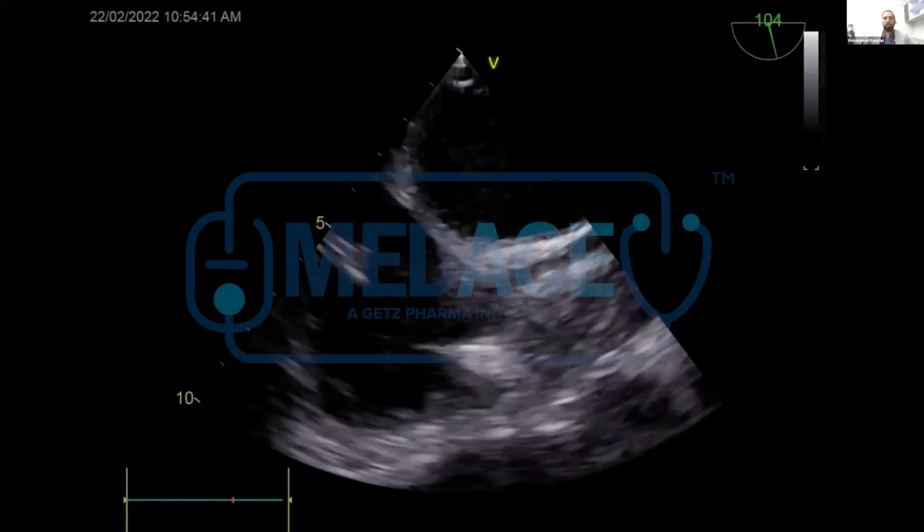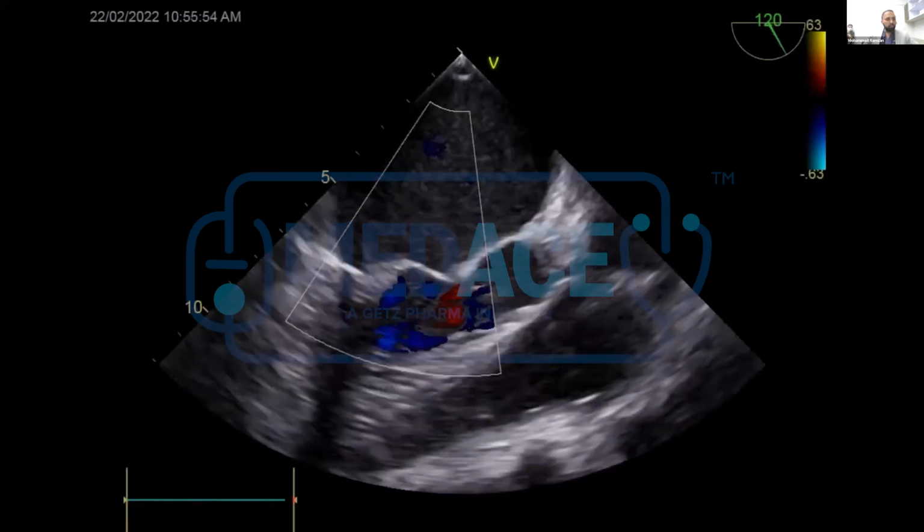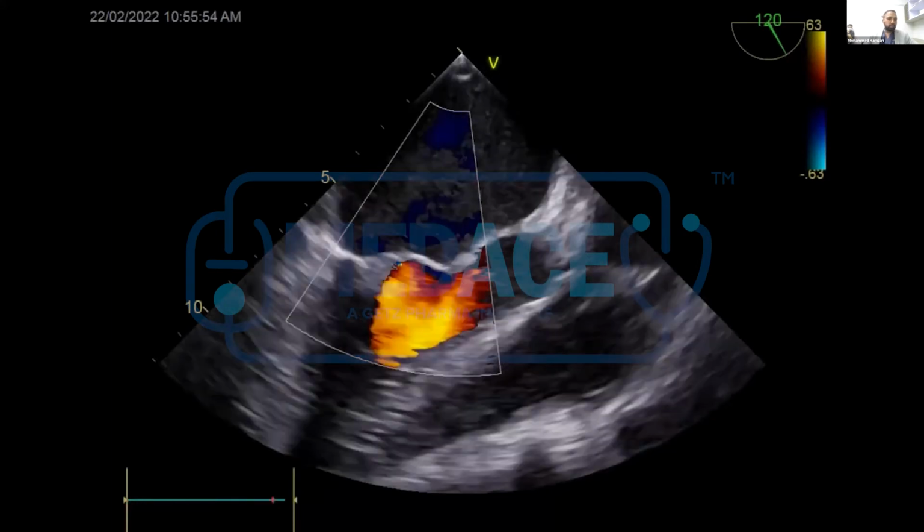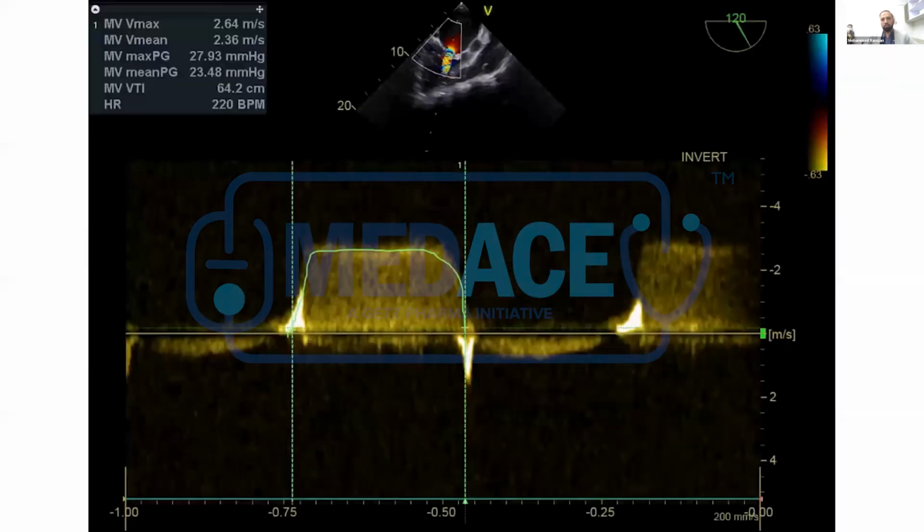So in the cath lab, first of all we took the access on the right femoral vein and the artery. The femoral vein access we took slightly lower than the arterial one, so that we can negotiate all the instruments which will be passing through this access site.